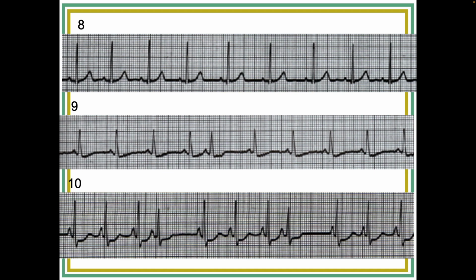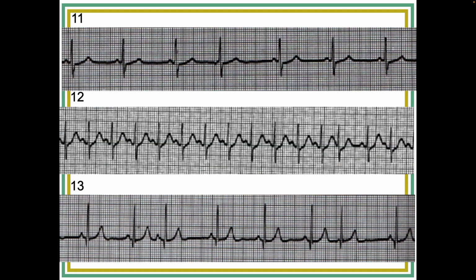Now, what makes the one that Cody did a little bit difficult is the fact that this one is short, but it's not tremendously short. This one is long, but it's not tremendously long. However, if you compare this one to that one, there's a big difference. It's a short one followed by a long one. And we might think, oh, could that be within normal limits?